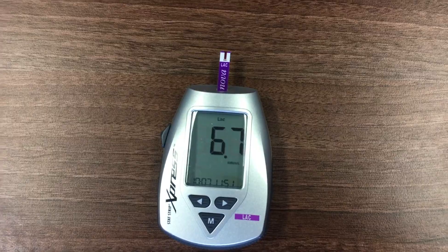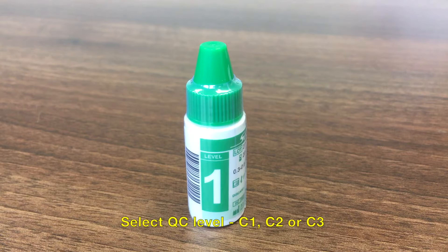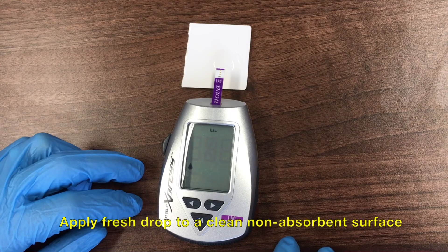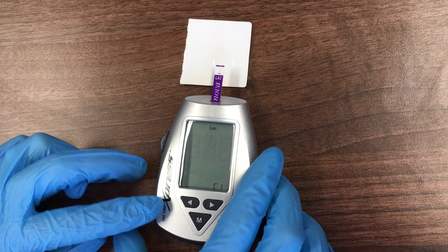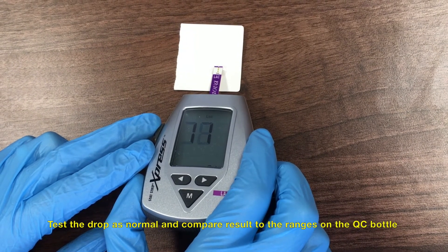Alternatively, when the flashing blood drop is displayed, use the left or right buttons to enter the quality control mode. Select the desired control level: C1, C2, or C3. When testing QC, thoroughly mix the bottle, discard the first drop, and apply a drop to a clean, non-absorbent surface. Test the drop as you would a normal sample and compare the results to the reference range on the bottle.